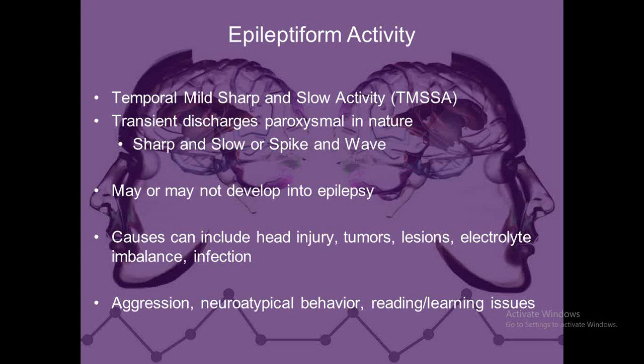A study by, who was that guy? I just had him down this morning. Hara, H-A-R-A, years ago found that 25% of the children in whom you find spike and wave activity will develop epilepsy by the time they hit their early 20s. Now, I think that's pretty accurate.